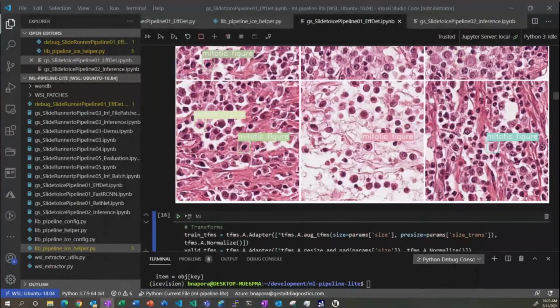That's not the one I was looking for. So color generally impacts it significantly, and in fact, what others have seen, even within the same data set, if they were scanned on different scanners, had significant variation in accuracy.